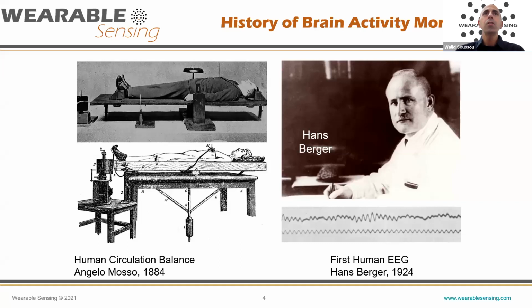So to start off the story, we will go really quickly into the history and introduce you to the early human circulation balance developed by Angelo Mosso. The idea there was you put a person on a sort of tipping table and you ask them to think deep thoughts or give them some challenging problems or emotional thoughts, and you watched as the blood flows into the brain. So sort of a very early functional near infrared. On the other side is, of course, the first human EEG recordings by Dr. Hans Berger in the early 20th century. So that's just a little bit of anecdotal history.